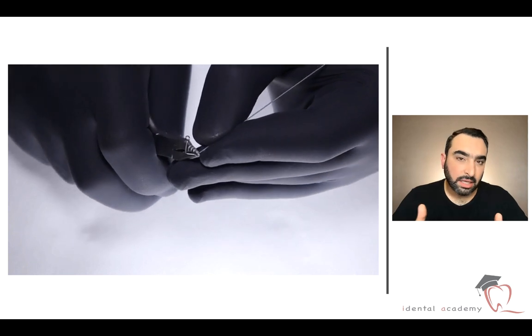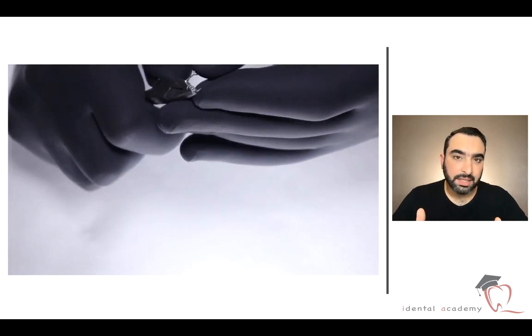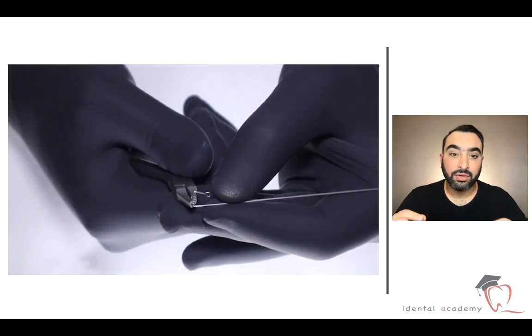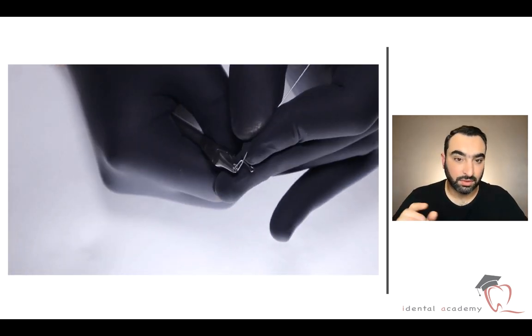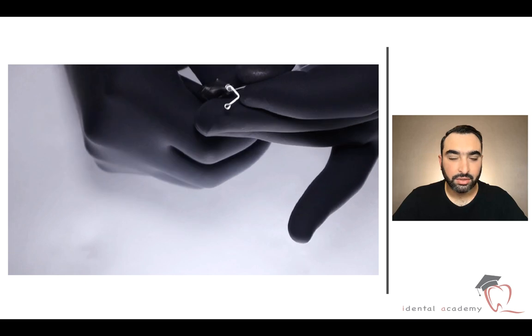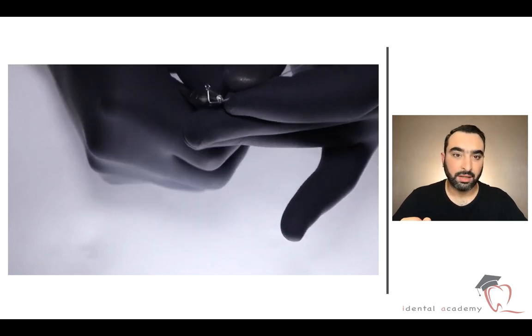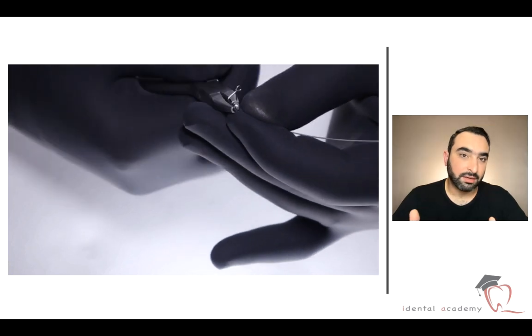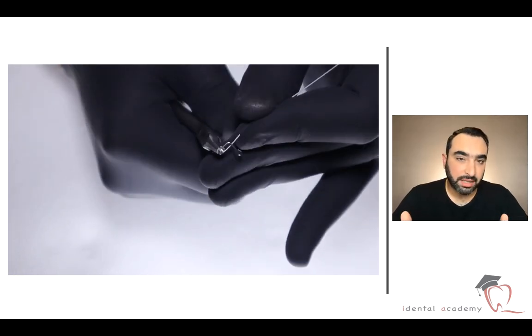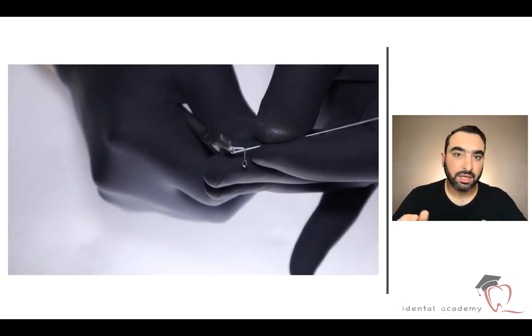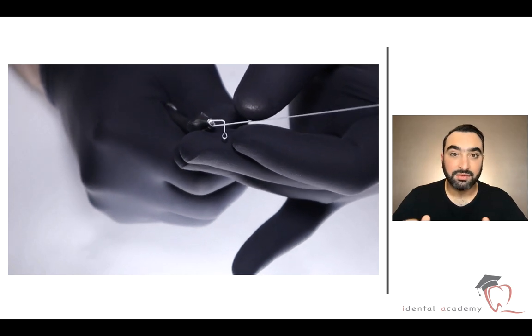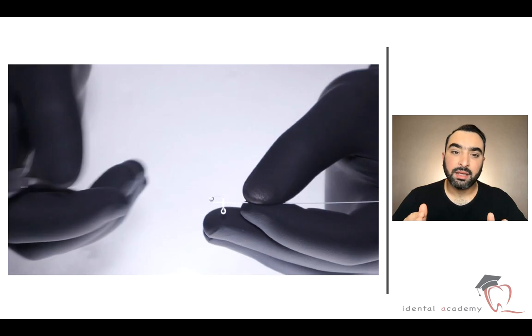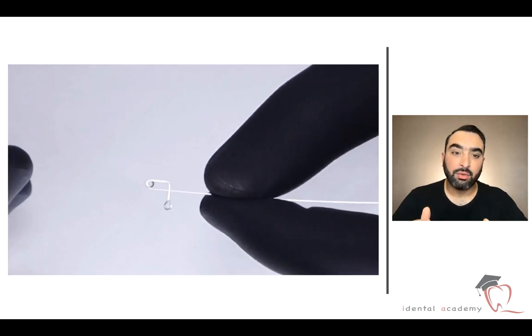The length must be six millimeters, but you have to increase it if you have long canine. So if you study your case very well you will know how to make the loop very well. And if the canines are less than the usual length, you can make it shorter, especially if you have a special need for your patient.